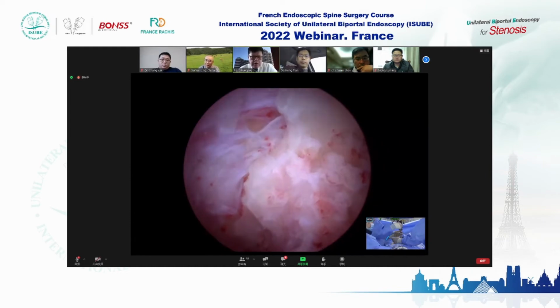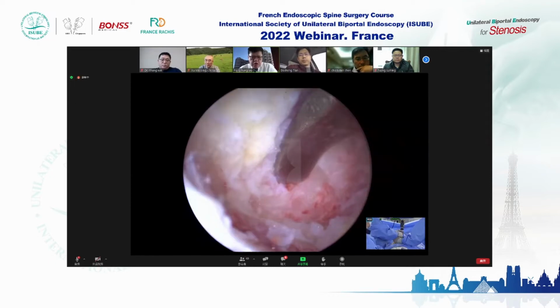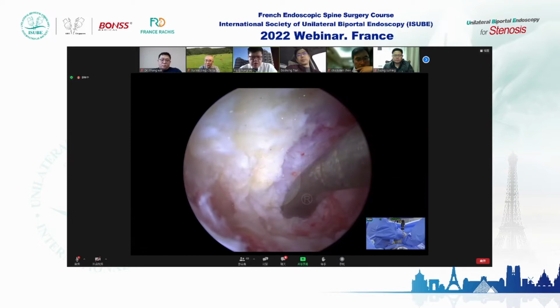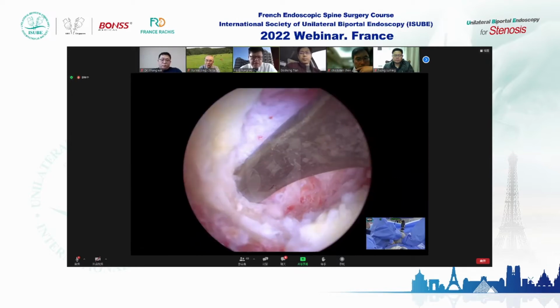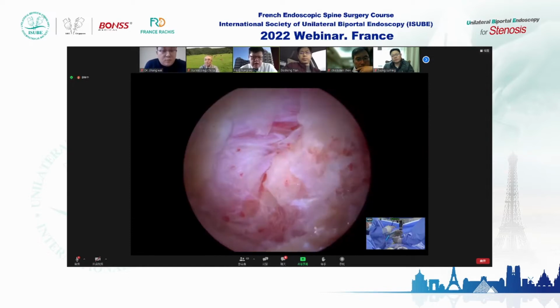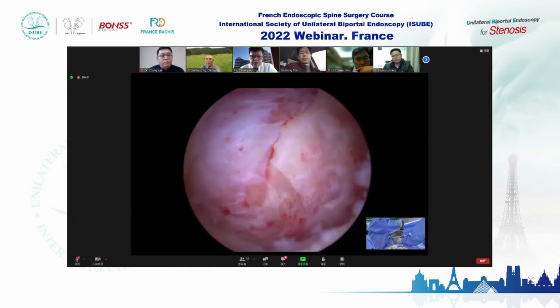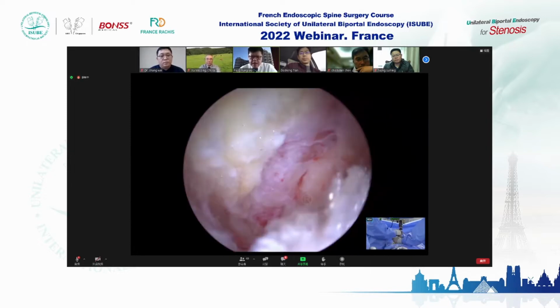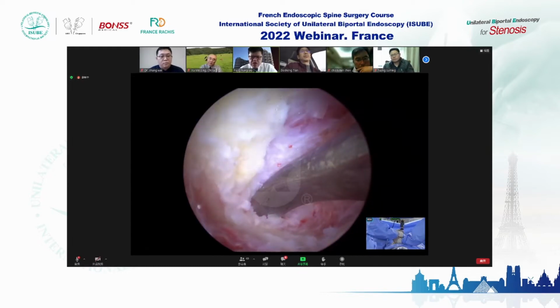Song is the typical attachment of the rotator muscle. The second point that Dr. Zhang Wei was mentioning, and also Dr. Song, is the B point, which is the bony convergence of the C5-6 articular process, the facet joint essentially. And the third point, I think Dr. Song repeatedly emphasized, is to identify the pedicle, the medial superior margin and the lateral superior margin of the pedicle.